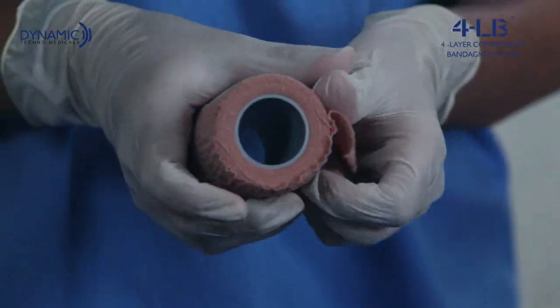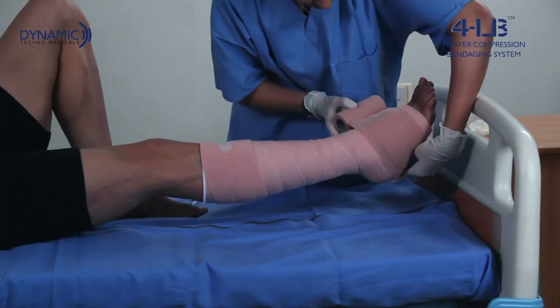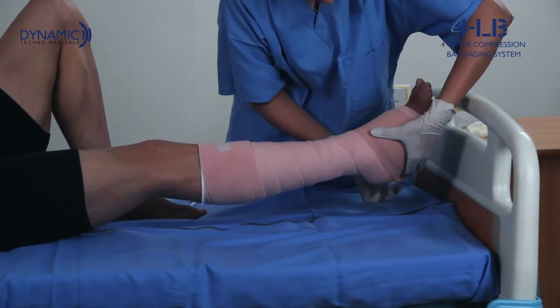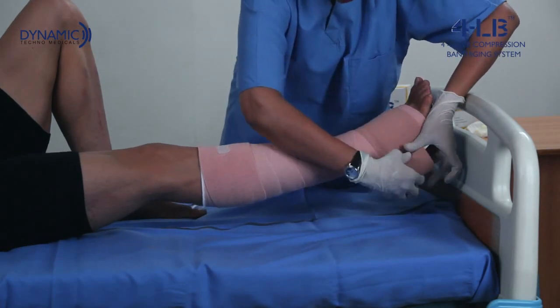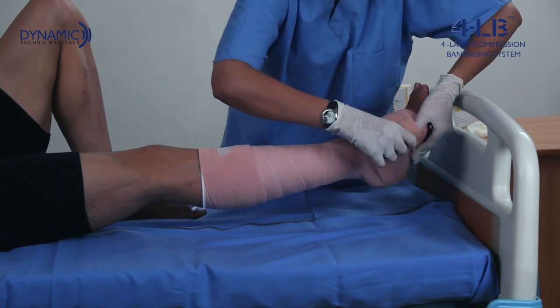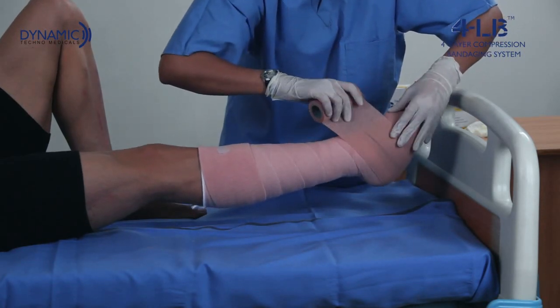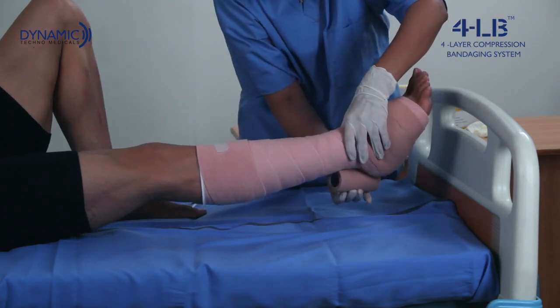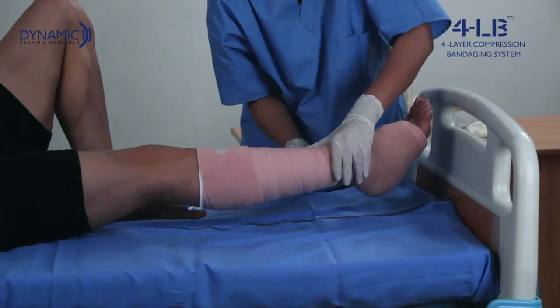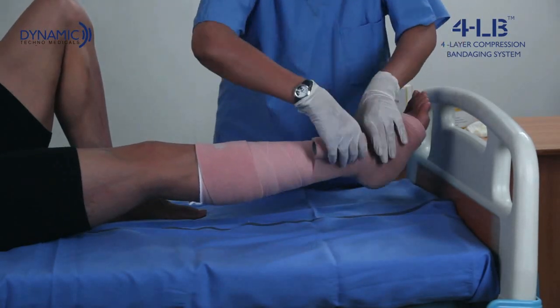The fourth layer is a cohesive bandage which is self-adhesive. Start bandaging from the base of the toe, but care should be taken not to allow the bandage to touch the skin where it could drop — leave two to three millimeters at the edge such that the earlier bandage can be seen. The bandage is applied in a figure of eight pattern at the ankle and in a spiral pattern with 50% overlap up the limb.